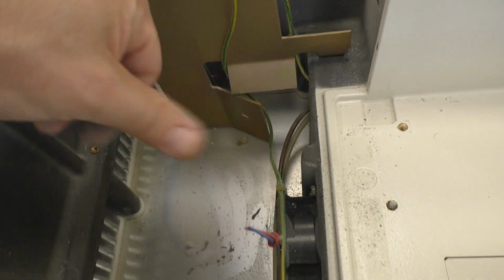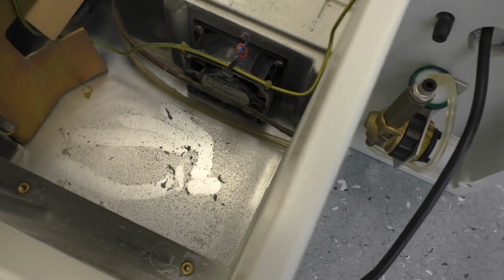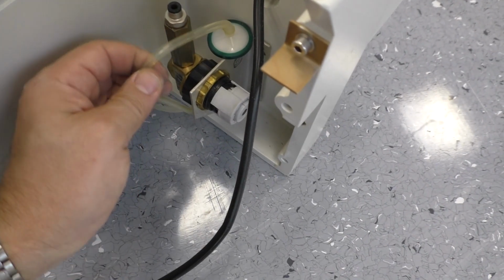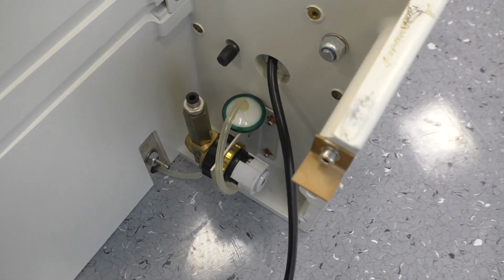And whenever you see this green dust here, this fuzzy greenish grayish dust, this is from the operation towels. I always say operation because that's in German, from the surgery towels and all those blankets. They are mostly green, and all that dust here comes from all that green tissue towel stuff. Okay, another interesting part here, a little filter with a green border, and I would say it's some kind of pressure regulator. Yes, could be.